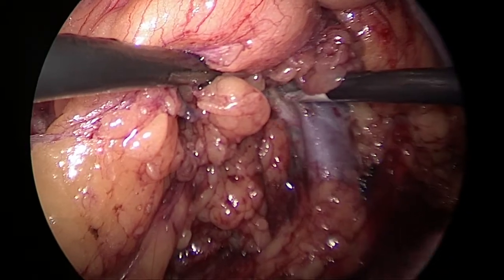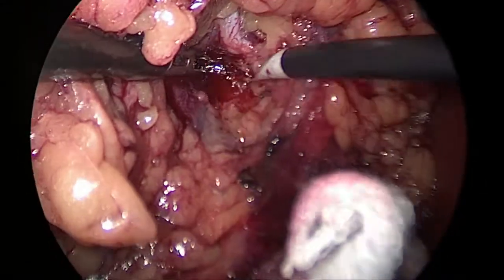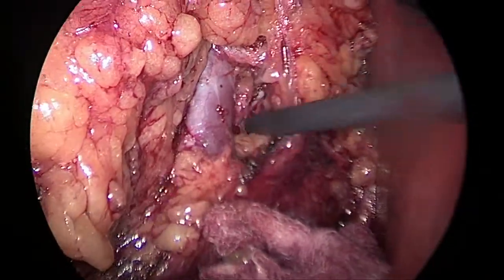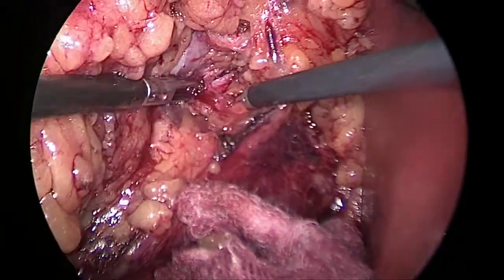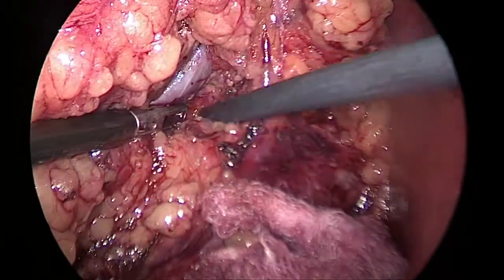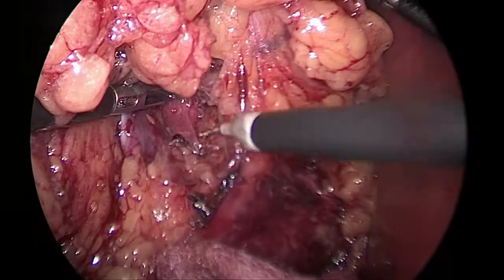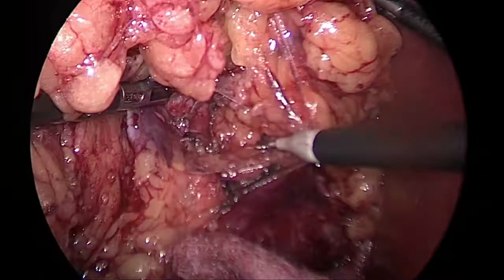Here you can see an artery, but this artery is a small one. So I am thinking that it might be a branch. So I am dissecting above the renal vein, and you see I got the main trunk of the renal artery. Above the artery there are adventitial coverings. This is to incise with the hook.